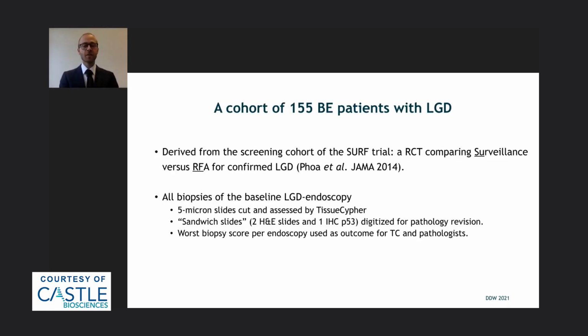For this current study, we used 155 Barrett's patients with low-grade dysplasia. This cohort was derived from the screening cohort of the SURF trial, an RCT comparing surveillance versus RFA for confirmed LGD cases. So we used all the biopsies of the so-called baseline low-grade dysplasia endoscopy.